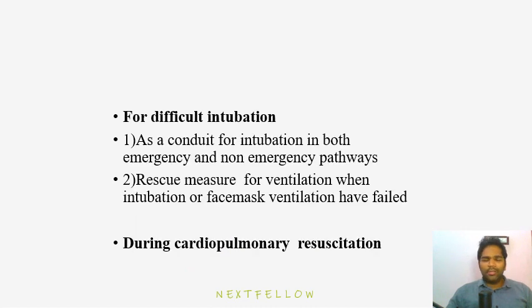Some people use LMA before difficult extubation, and for difficult intubation, since we know some LMAs can be used for intubation also. So in both emergency and non-emergency pathways, it can be used for intubation and as a rescue measure. Like during arrest, when you are not able to intubate, you can use this LMA as a rescue measure.